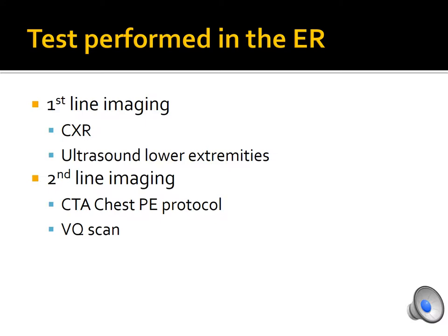Even though the provider may be worried about a pulmonary embolism, they will usually do the lower extremity ultrasound first. This is so they can avoid radiating the patient and the fetus. As the treatment for a positive DVT, if seen on the ultrasound, would be the same if they were diagnosed with a PE. Both of these exams happen to come back negative on this patient.